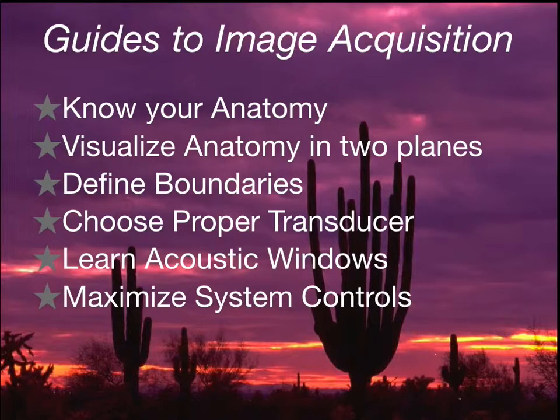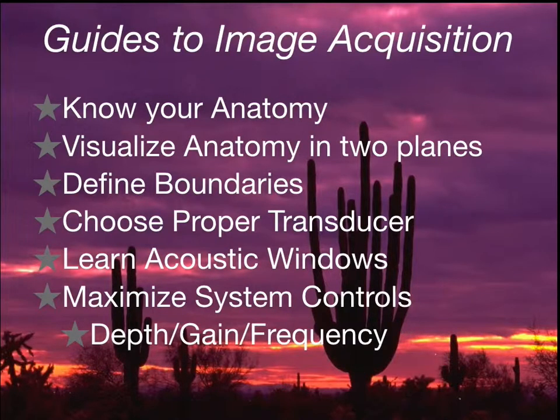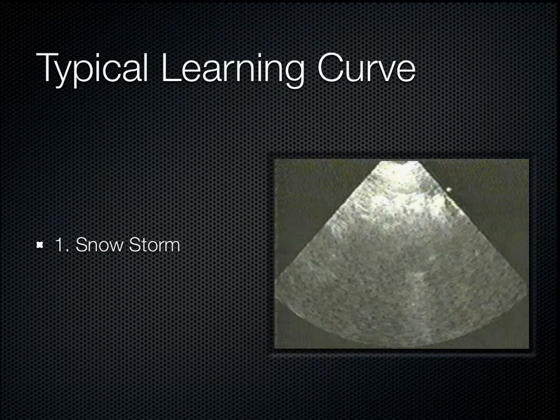And then you want to learn how to maximize those system controls. The depth is the most common button I push, and certainly adjustments of the gain and occasionally the frequency. Now, people always ask me, what is the typical learning curve of ultrasound?